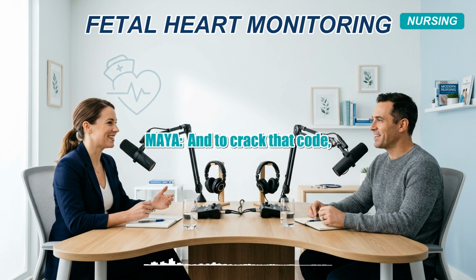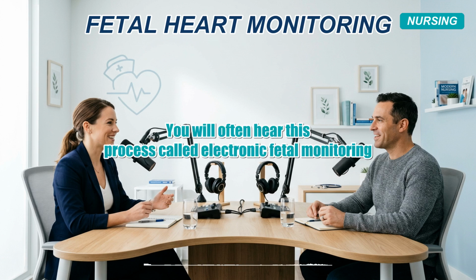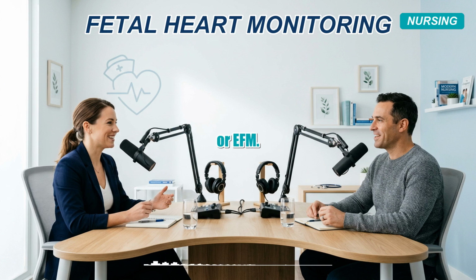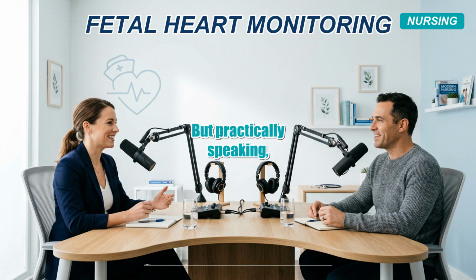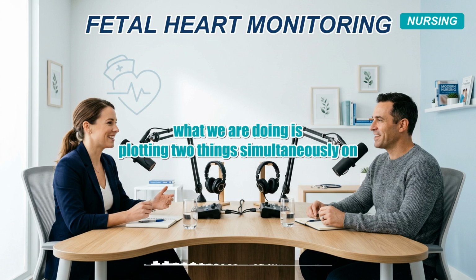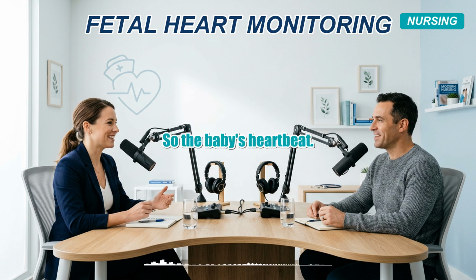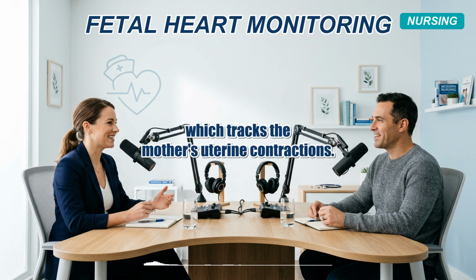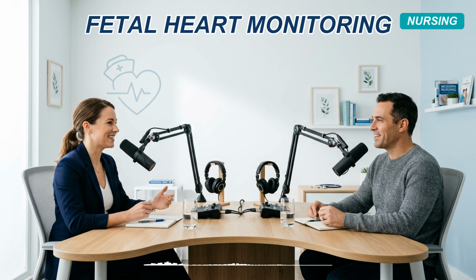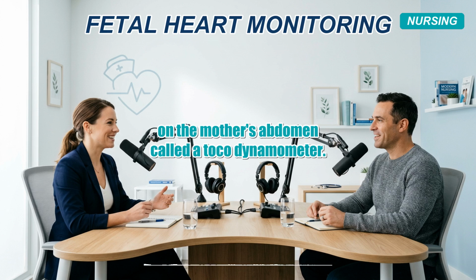And to crack that code, we first need to lay out the terminology cleanly. You will often hear this process called electronic fetal monitoring, or EFM. Or sometimes CTG, right? Yes, in some regions it's called cardiotocography, or CTG. But practically speaking, what we are doing is plotting two things simultaneously on a graph over time. The top line is the fetal heart rate, so the baby's heartbeat. And directly below that, on the exact same screen, is the bottom line, which tracks the mother's uterine contractions. Exactly. That bottom line is recorded by a pressure sensor placed on the mother's abdomen called a tocodynamometer.